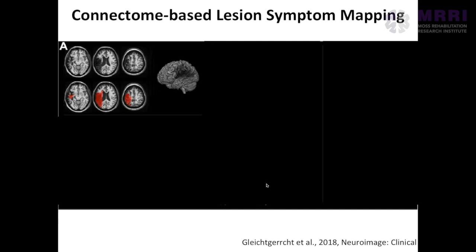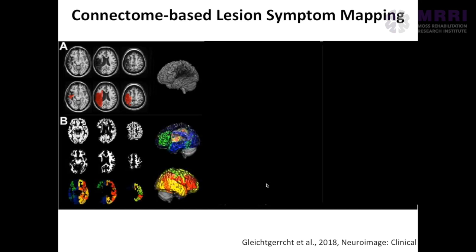And so what do I mean by connectome? Well, the approach typically looks something like this, where, we talked about this in session 1 with Austin, you have your participant's brain, their T1, and you draw in their lesion, okay? What you then do is, with various types of warping techniques, we use some of these as well, you can separate out gray matter from white matter, right? And you can see that some of the tissue is not there. That represents where the lesion is, okay?